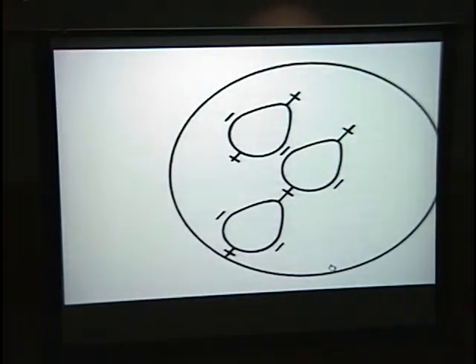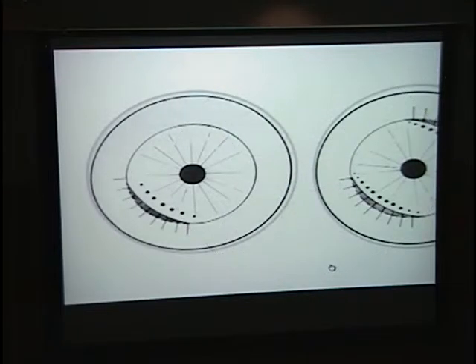This is the B&L keratometer image that we don't use because we have corneal topography, but this is what you see, and you have to remember that the flat bulge is 180 degrees opposite of where the really flat spot is on the cornea.